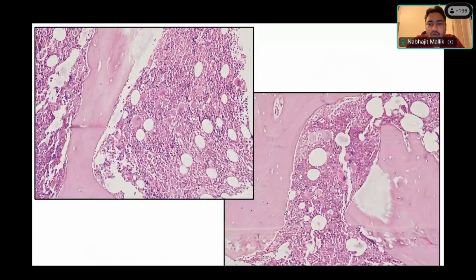Then we go ahead and look at the bone marrow biopsy at a closer picture. Bigrai, what do you see here? I can see the megakaryocytes are increased in number. Definitely increased in number. In the aspirate the morphology is not greatly appreciated here, but yes, we can see some large ones like these and some small and normal sized ones like these as well. So the pleomorphism that we noted in the aspirate is there, and there is definitely some clustering also. You can see these 3 or 4 megakaryocytes lying together. So loose clusters are being formed here, and they are also lying close to the trabeculae.